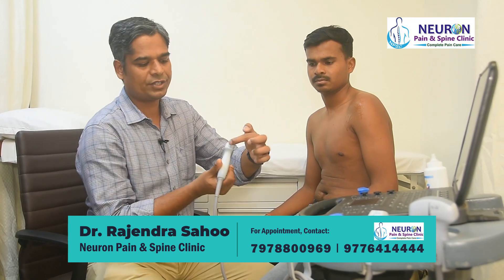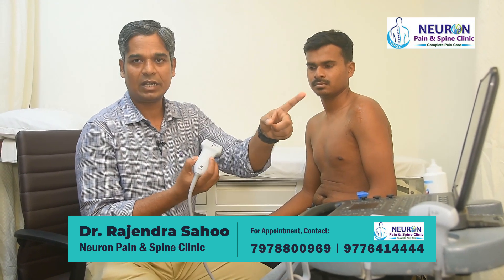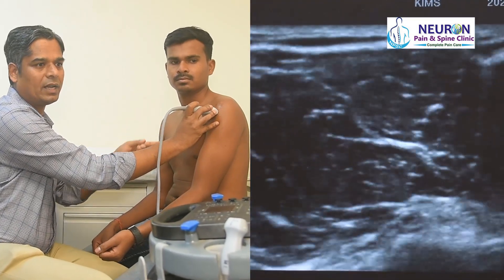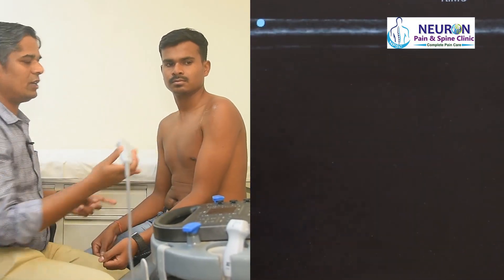On this probe, there is an orientation marker that points to the left of the probe, and this is the right. So if I put it over here like this, what you're going to see on the left is medial and on the right is lateral. Let's start.